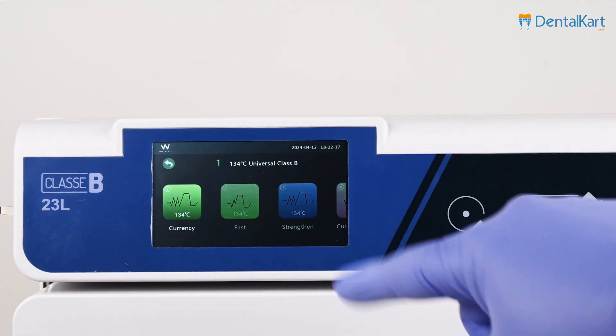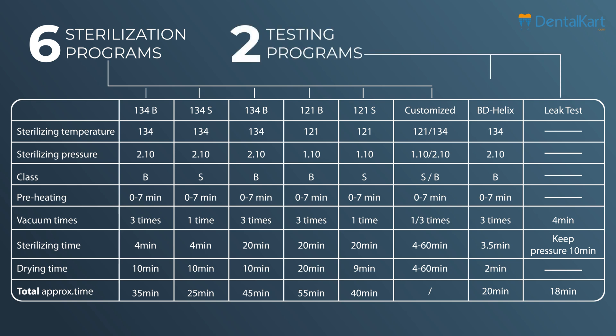The Walden Schuster Autoclave has 6 sterilization programs and 2 testing programs, allowing for a versatile range of applications.